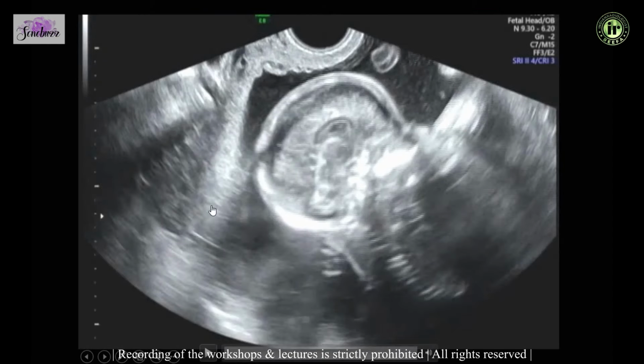And these are some techniques. You can see here that this is a fetus which we are pushing with the hand.